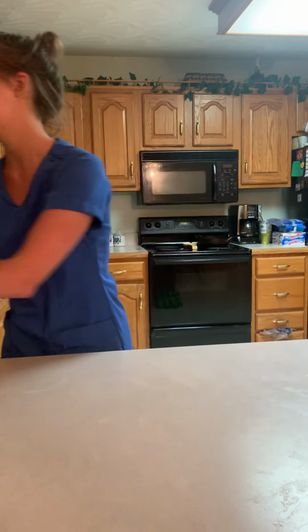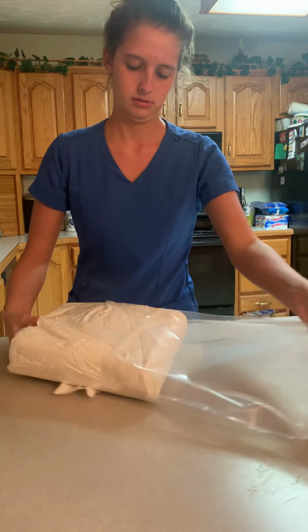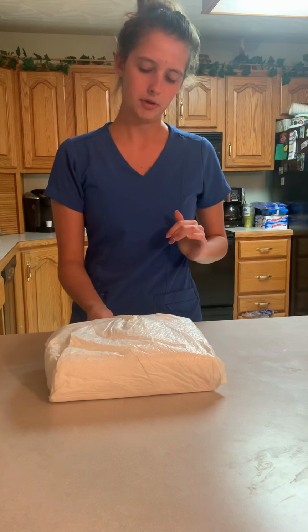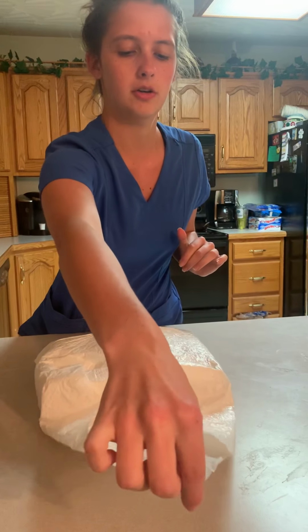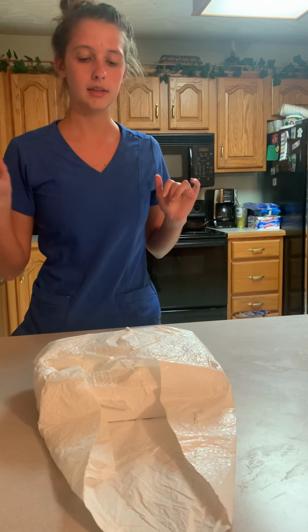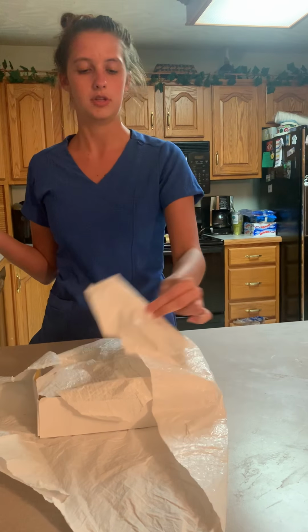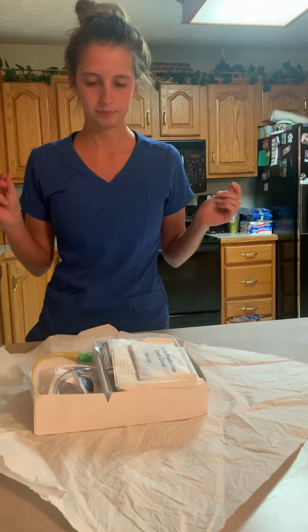Okay, next we're going to go ahead and get our catheter kit tray ready to go. Alright, so we're going to open up the kit, and we're going to open away from us first. And then we're going to open to the side of us first, and then to the other side of us first, and then down.